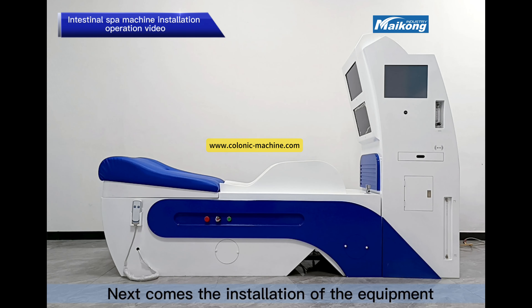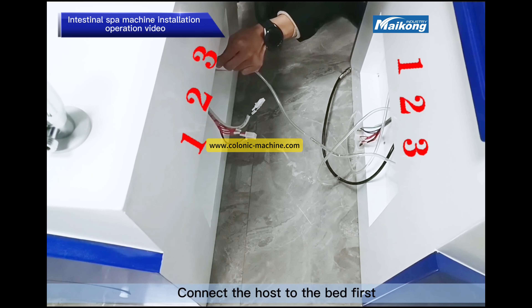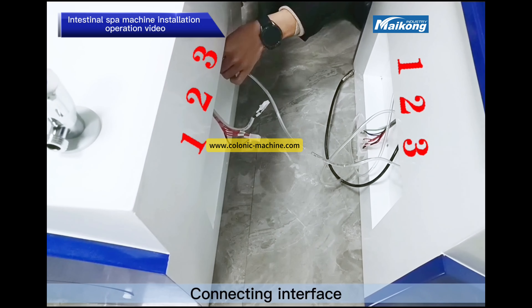Next comes the installation of the equipment. First, place the bed body and host in the proper installation position. Connect the host to the bed via the water hose, matching the corresponding numbered connecting interfaces.